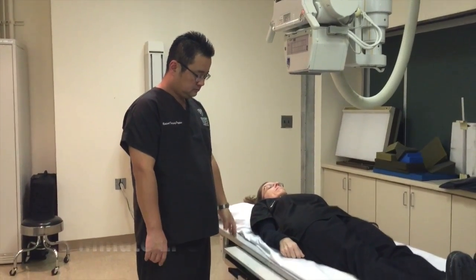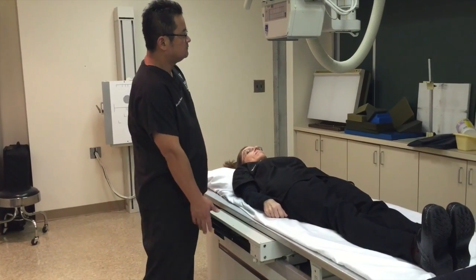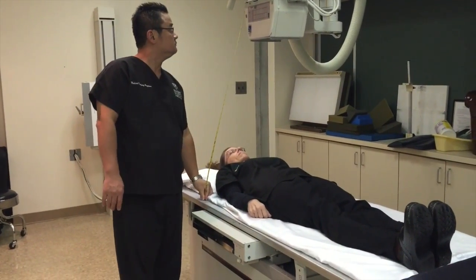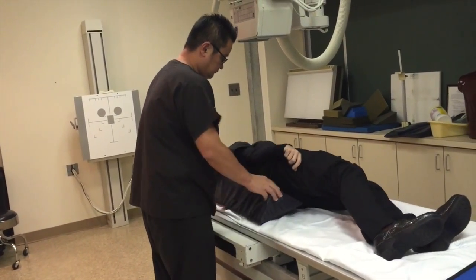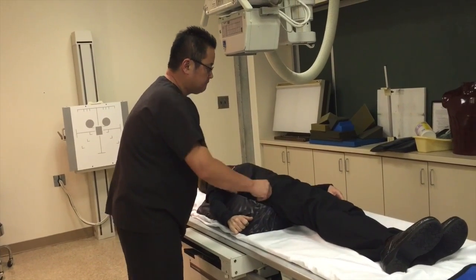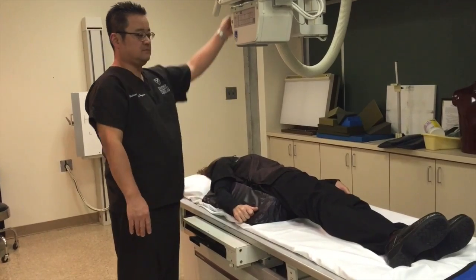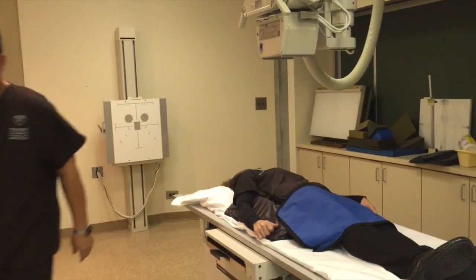Next, the technologist will take a 20-minute LPO oblique position at 30 degrees. The tech will place a 14 by 17 IR lengthwise in Bucky with the right marker in the bottom corner. He will then set an SID of 40 inches and center at the level of the iliac crest and 2 inches lateral to the mid-sagittal plane toward the elevated side.